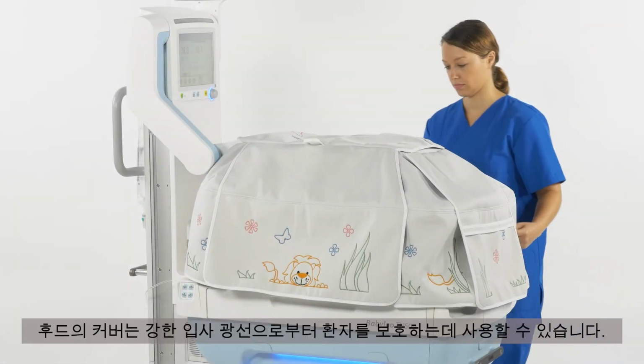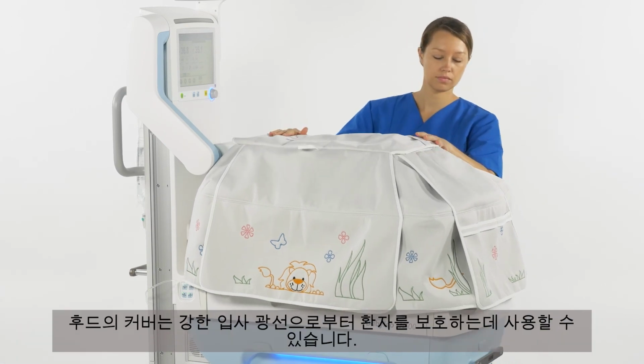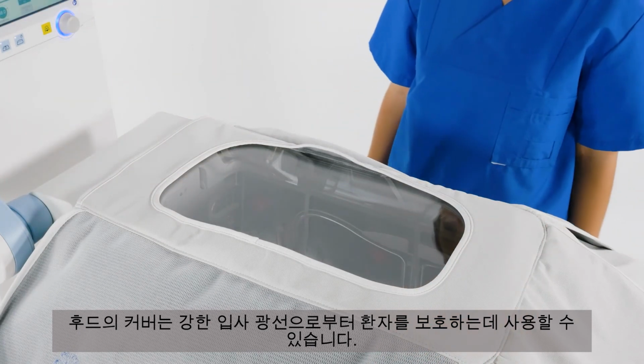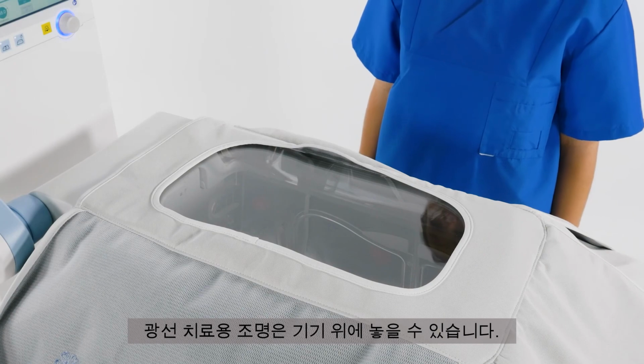The hood cover can be used to protect the patient from strong incident light. It also dampens ambient noise and has a flap on the top which can be opened for phototherapy treatment. A phototherapy light can then be placed above the device.